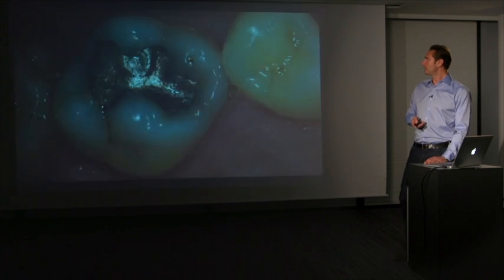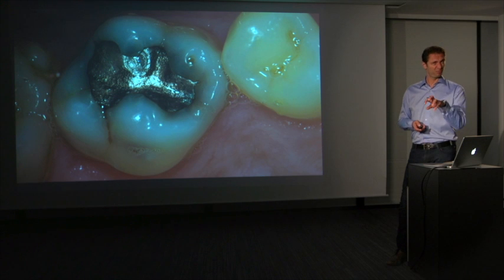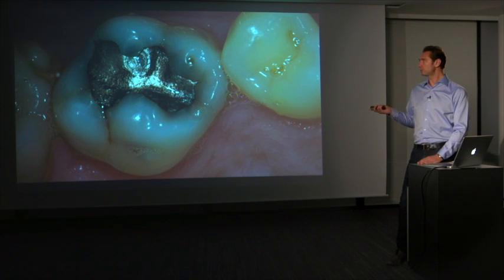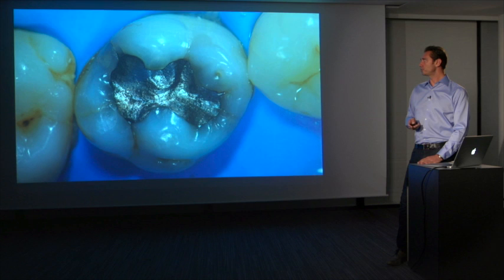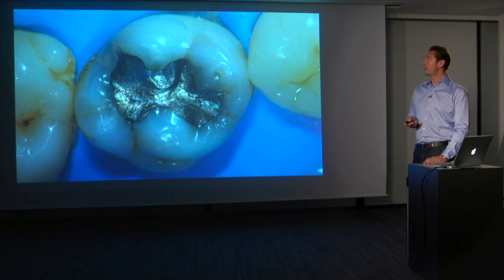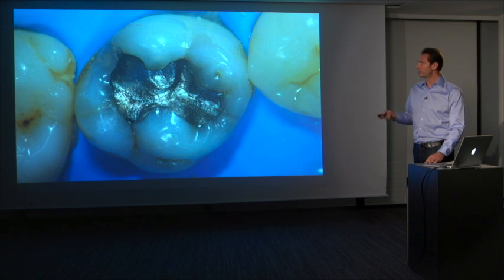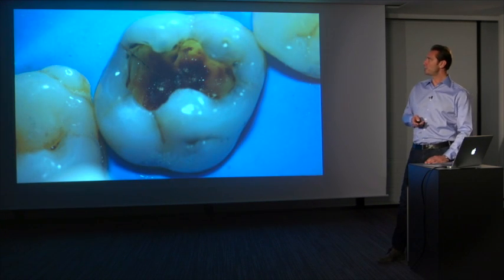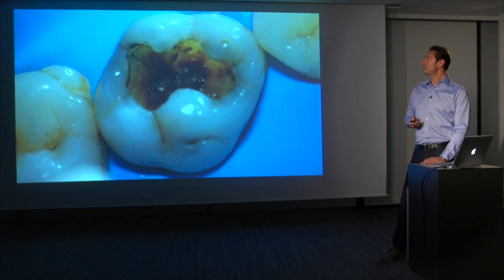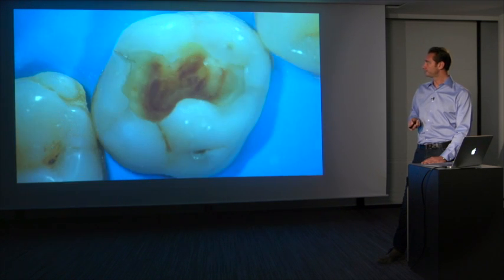Another case which is, let's say, challenging. It's a purely occlusal, initial occlusal approach, but it will show you how the cavity design might change, because here we will do a cuspal coverage, and it's exactly the fracture that you can see in this area. So initial situation, we have the same protocol. Initial situation, rubber dam in place, we remove the old restoration, we clean out the cavity, we clean the decay.